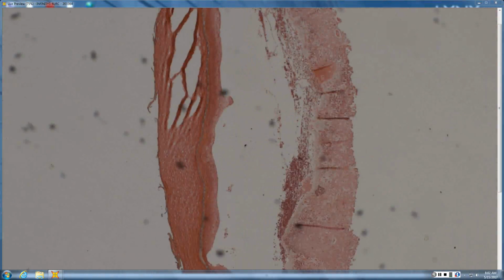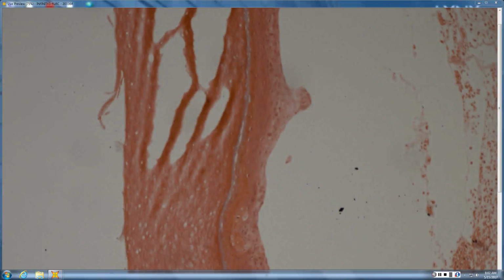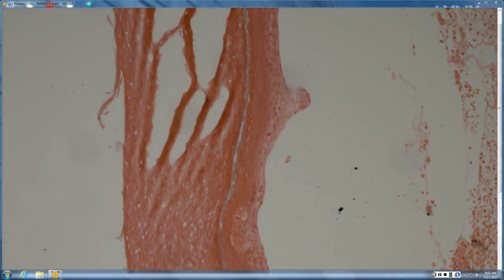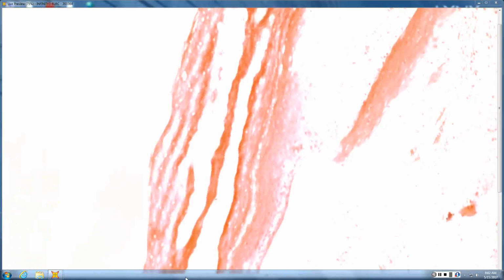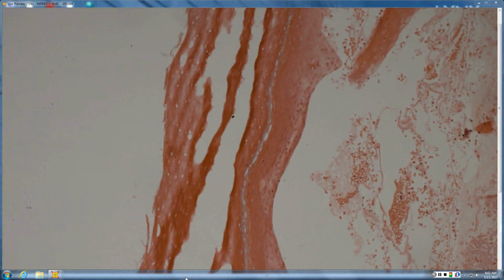And we have a blister, looks like one subepidermal. Subepidermal blister, heavily sun-damaged skin, and then in the epidermis you have this kind of funny structure, sort of down the middle of the epidermis. Something different altogether. So, anyone thought? Like a caterpillar body. Well done.